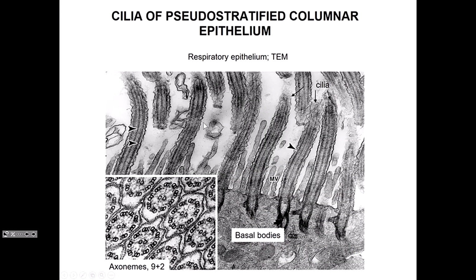Okay, and then here's some surface specializations. Our cilia again. Here's our true cilia being nucleated from a basal body, which is a centriole. The centriole actually has triplets of microtubules, and we'll see that on Wednesday. That gives rise to these doublets of microtubules, which then form the cilia. And in cross-section, of course, we see a really good section of a cilia, the 9+2 arrangement of microtubules, which is that distinct histological feature of a cilia, which plays a role in motility of cilia.